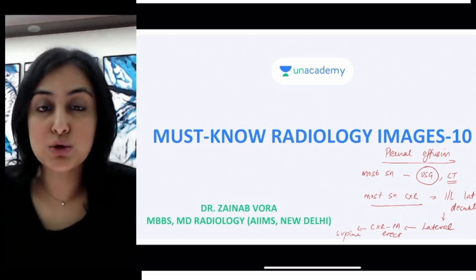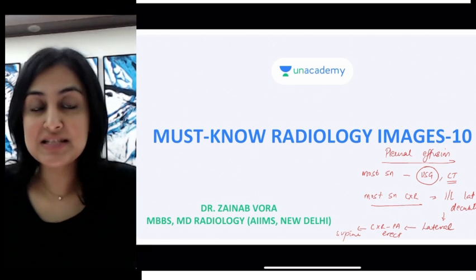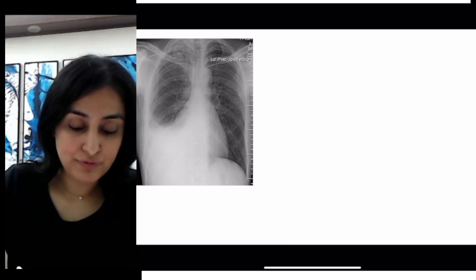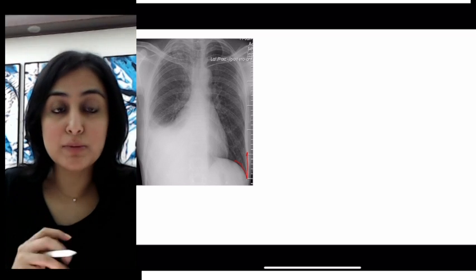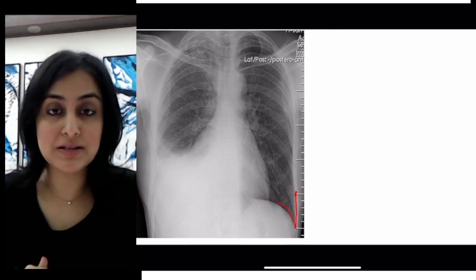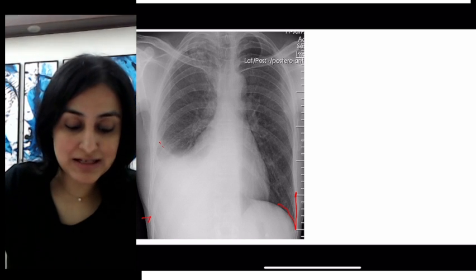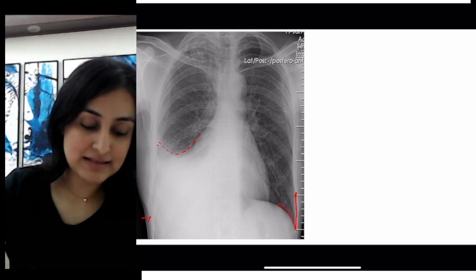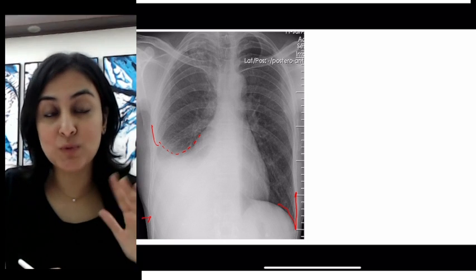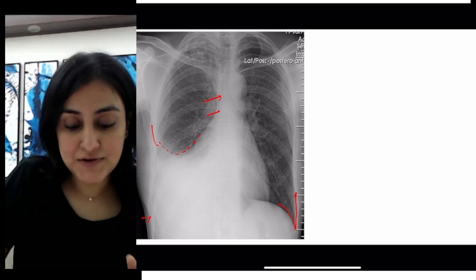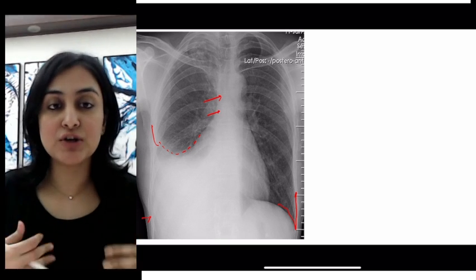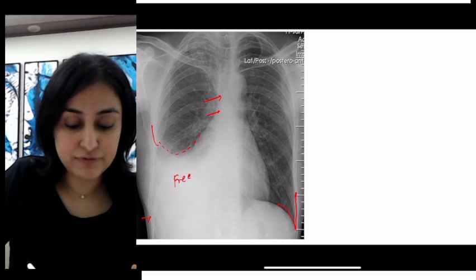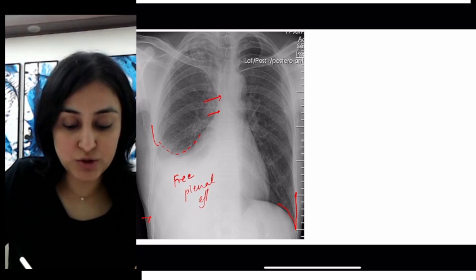Now let's look at the various types of effusions on imaging. The first image is a frontal erect radiograph. A normal costophrenic angle appears sharp. When there is effusion, it is blunted and you see an opacity in the hemithorax with a meniscus forming upwards — also called the S-curve. This meniscus sign with CP angle blunting, and often contralateral mediastinal shift due to the effusion, is classic for free pleural effusion.